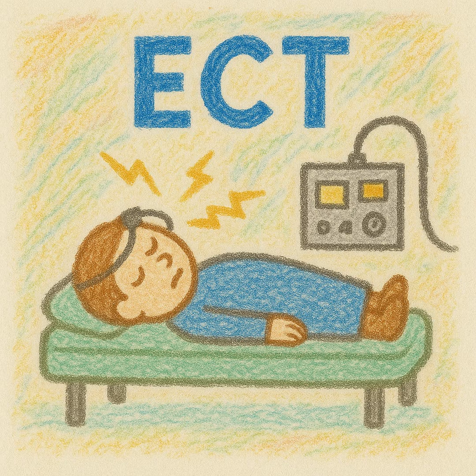For right unilateral treatment, in order to achieve equivalent clinical outcomes as bitemporal, you need to treat at much higher doses. So usually you're going to be treating somewhere in the range of 6 to 10 times the seizure threshold.